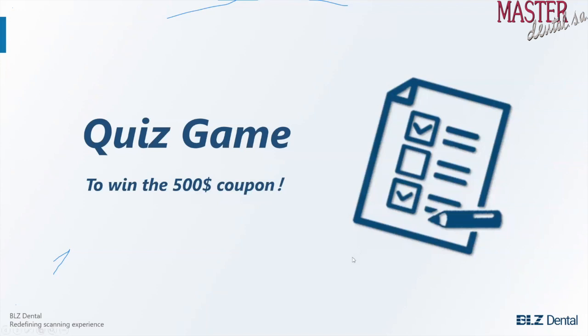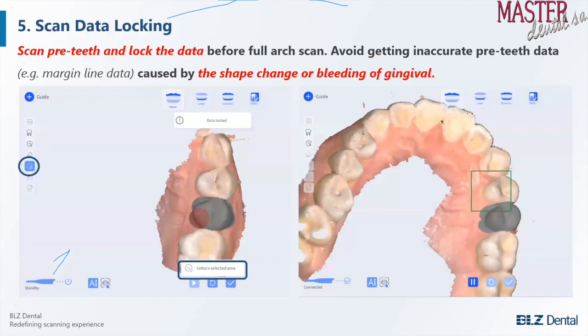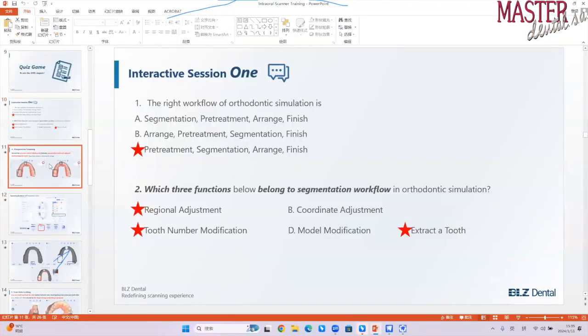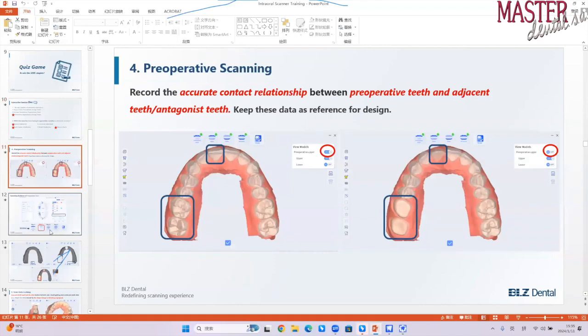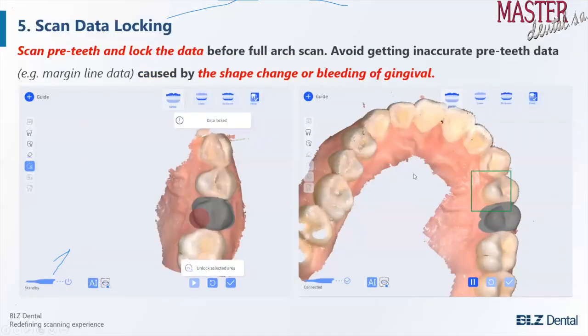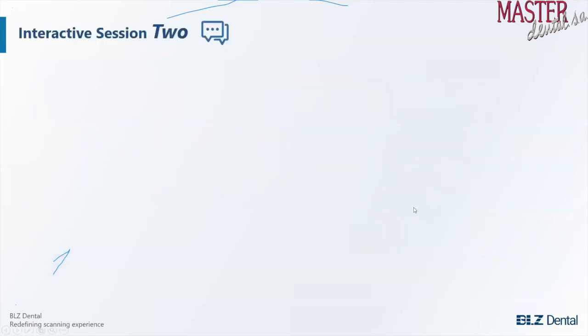Okay, the questions in this part of the quiz game are all about preoperative scanning and scan data locking. I hope you are ready for this part.